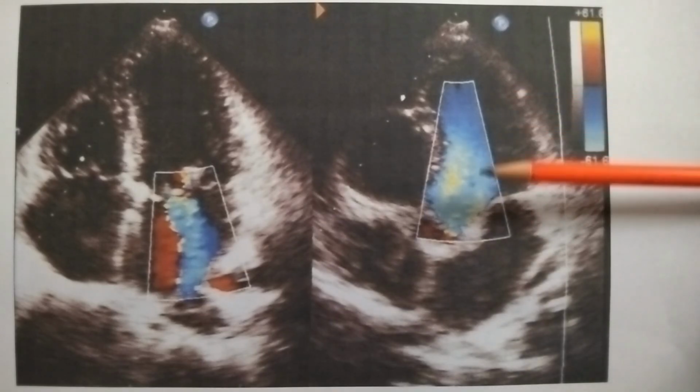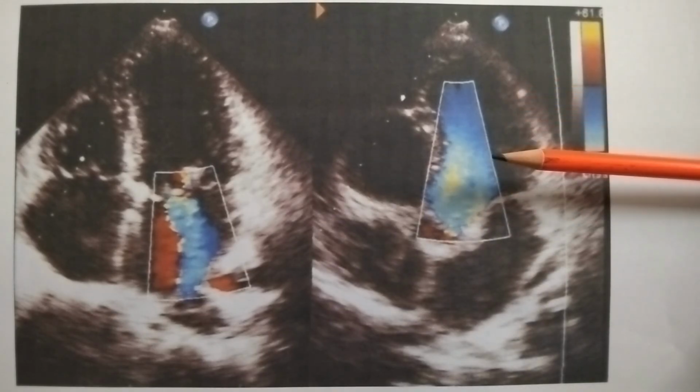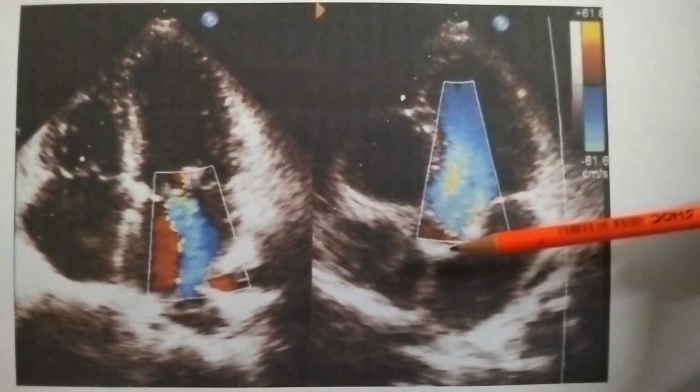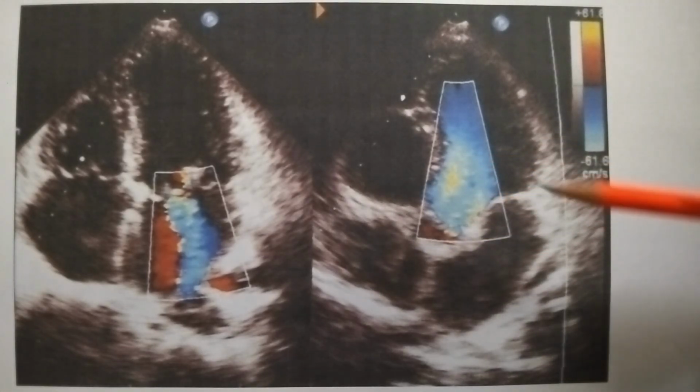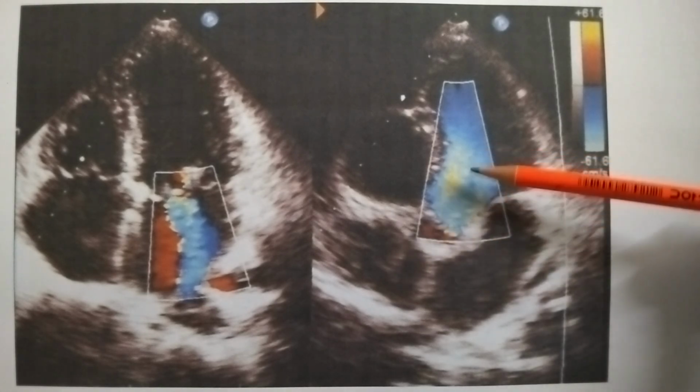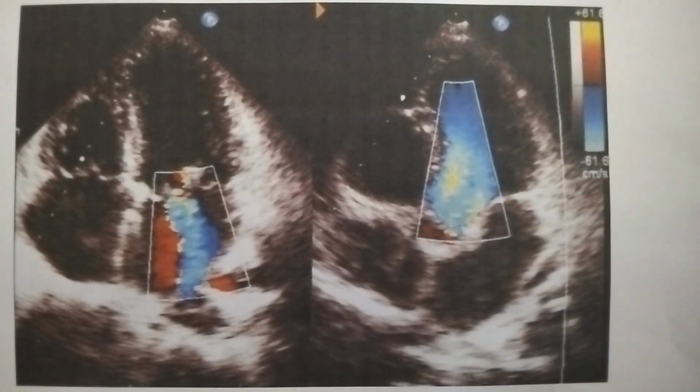This is a slightly tilted view known as apical 5-chamber view. In the 5th chamber, you take the 5th chamber as aorta. So aortic valve will be seen here. This is left ventricular outflow tract. And this is the color bar, which will show the maximum velocity which can be imaged without aliasing in this system. That is 61 centimeters per second.